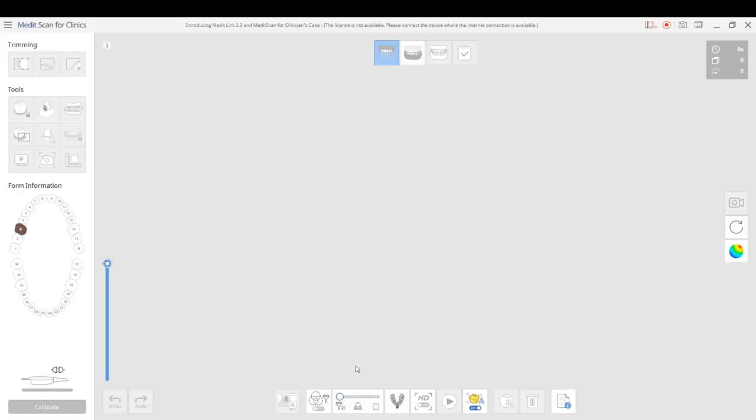So as an advanced user, I'll have color filters on, I'll have this cranked up, and I'll have this again set to full throttle because I don't want to slow things down. I want to pick up as much data as possible, and I'd rather manage the excess data that's getting in the way of what I'm trying to accomplish.